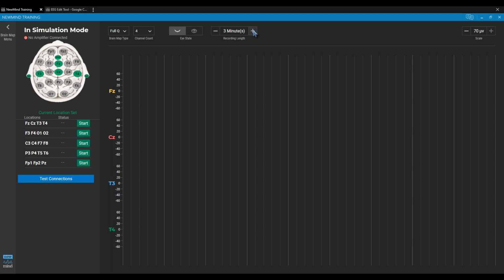And then some of us have had these clients that no matter what you do, it's just all artifact. So for them, if they really needed neurofeedback, I might skip the map and start off with some SMR for a bit, and at least train them there.